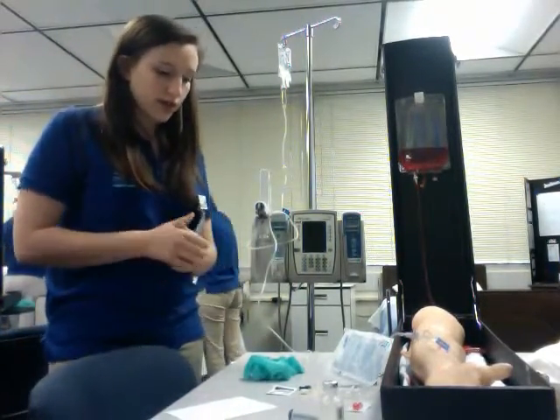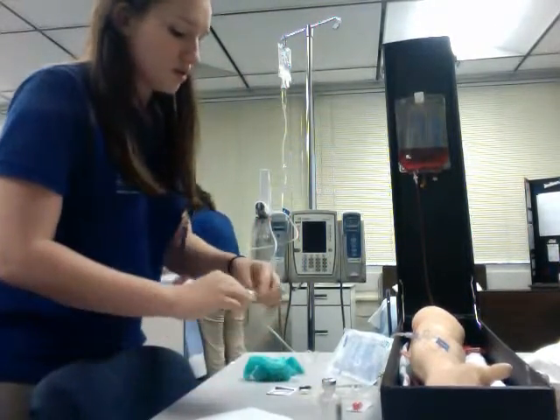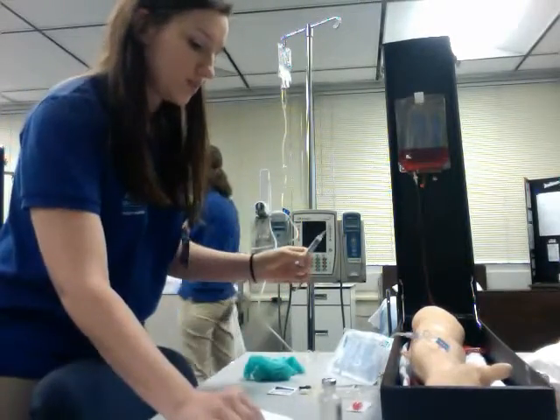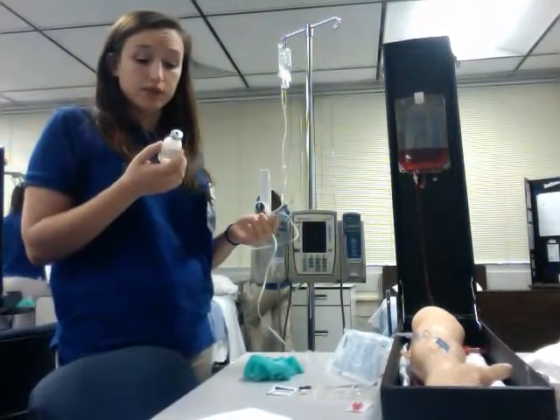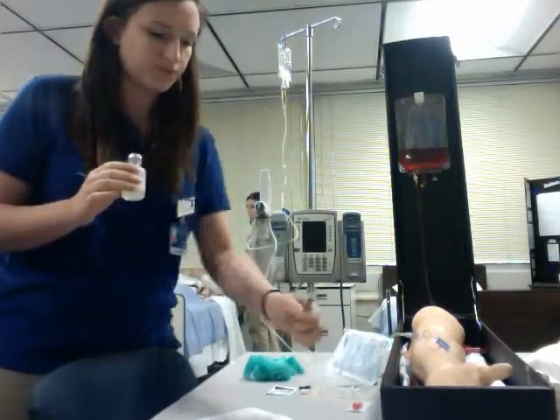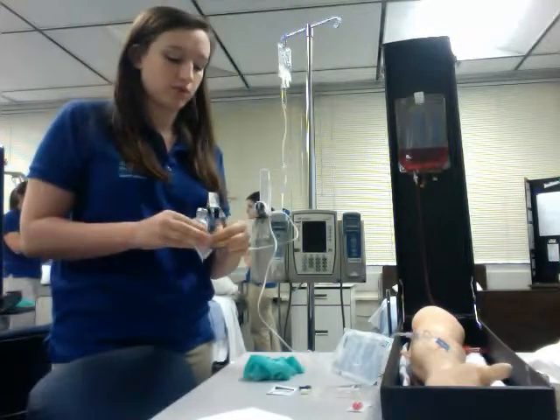So I'm going to start by performing hand hygiene, and I'm going to draw out my medication. So I've got my sterile syringe and needle. Since my medication bottle says that it is 1,000 milligrams per milliliter, I'm going to go ahead and draw up half a milliliter, since that is half of that, and I need 500 milligrams.